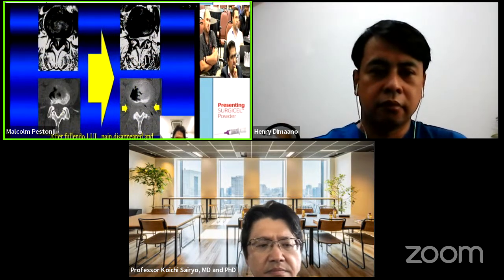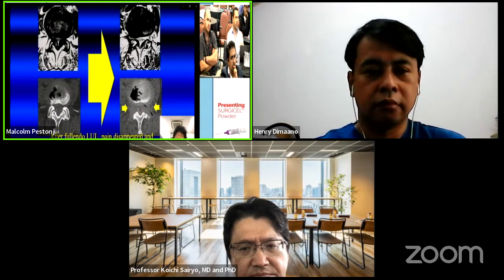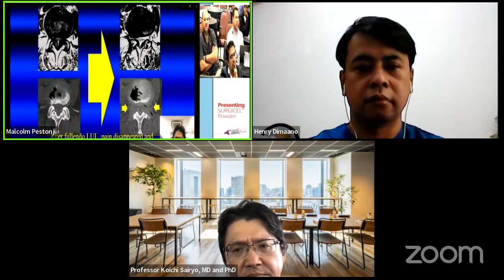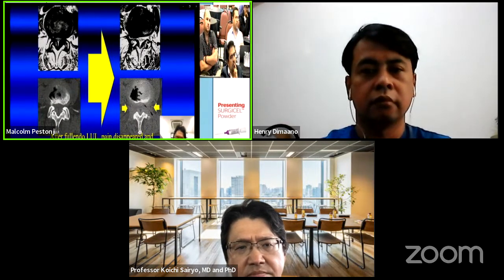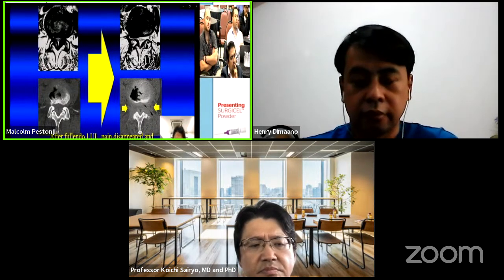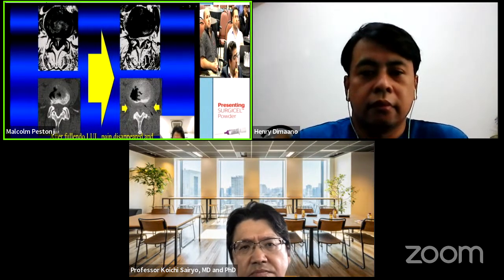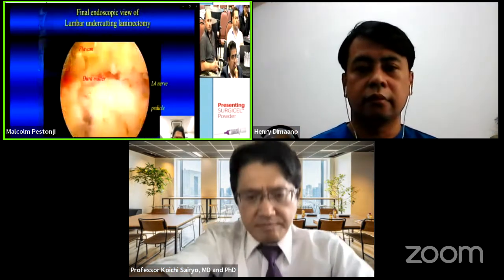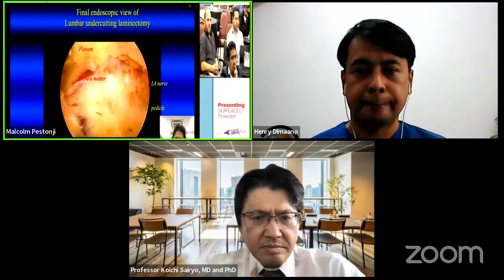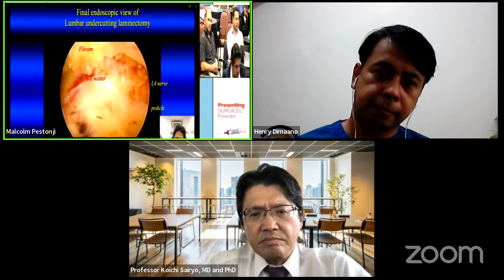So I performed under local anesthesia. See, this is the SAP total resection and undercutting laminectomy here. I could not remove completely the ligament fragment, but a part of the spinal canal is enlarged. Then pain disappeared. Also palsy improved within 3 months. This is the final view of undercutting laminectomy and also after removal of the ligament fragment. You see, there is nice beating of the dura mater.